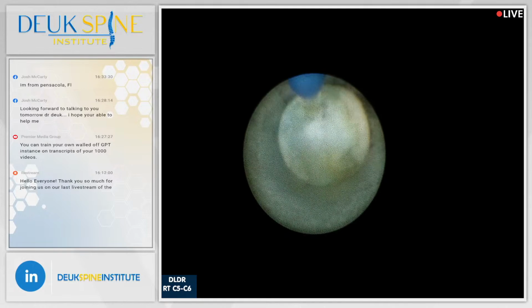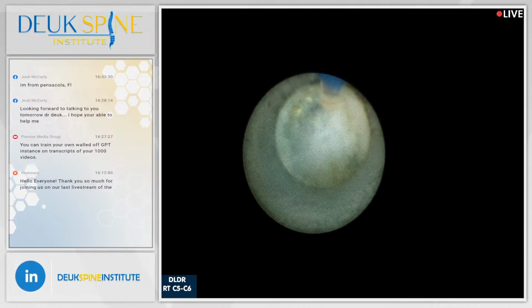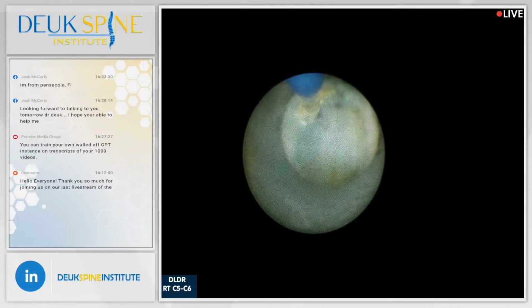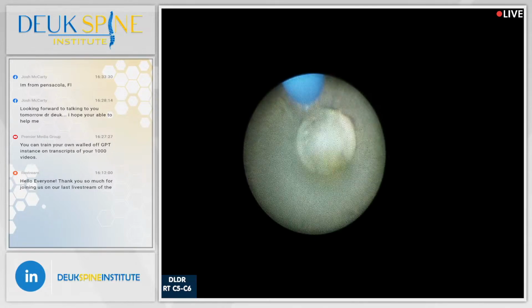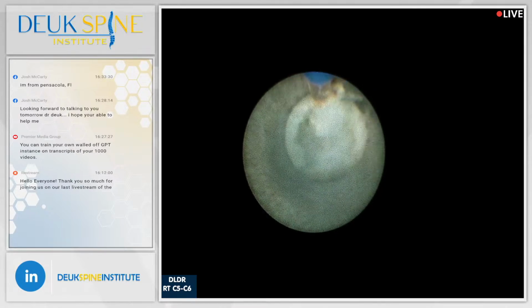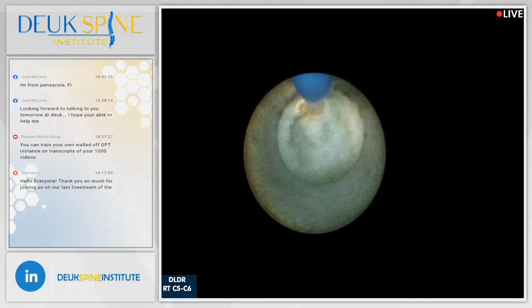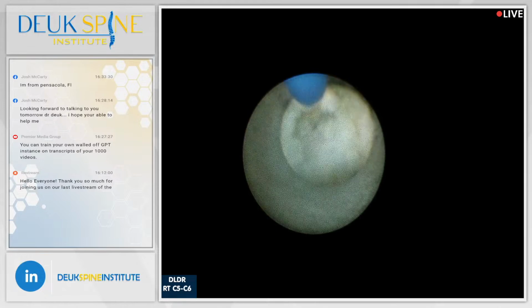You really want to try to get 50%. That will give you good relief for the patient. I've been removing these herniations now for 26 years. Just about done, guys. 26 years we've been taking them out. And, oh, there's one right there. That's a good one. It's scarred up. Gonna have to blast it with a laser.